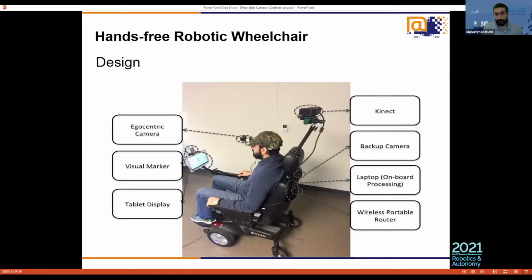Also, when we thought of the design, we also thought of having affordable equipment. We did not look to have very expensive sensors or devices. The equipment we used is comprised of simple wheelchairs where we hacked the joystick and replaced it with a microcontroller.